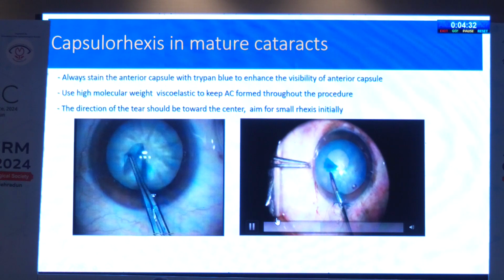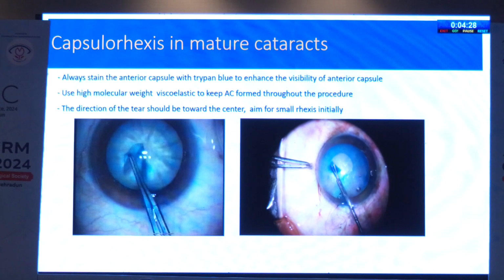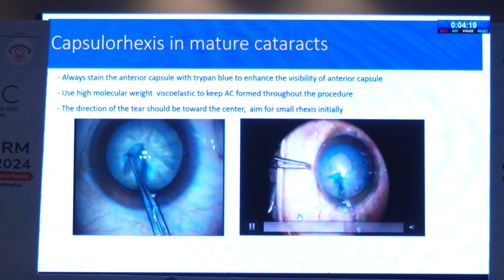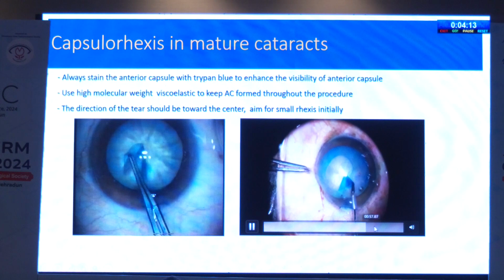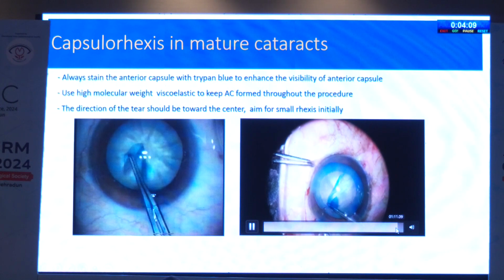Now again there is a problem. Actually, bad habits are very difficult to die. So I again introduced my microrhexis forceps through the main incision, because I was more confident with the main section. And anyhow, I completed the rhexis. And it's a beautiful rhexis, see.